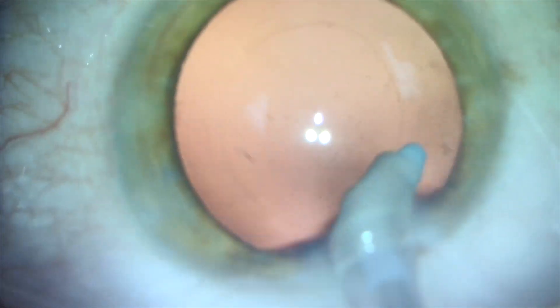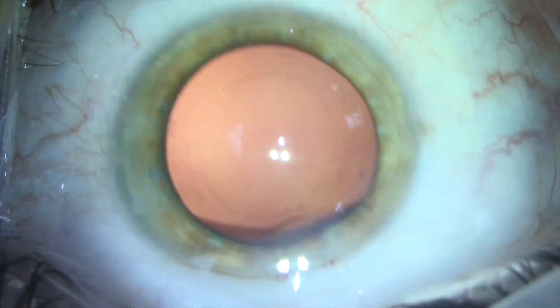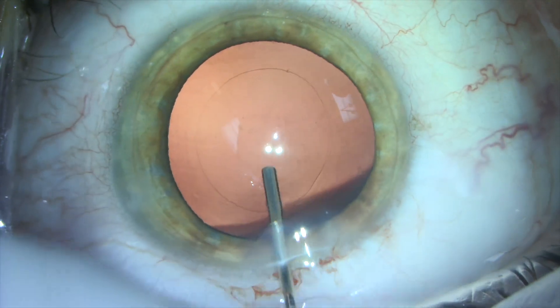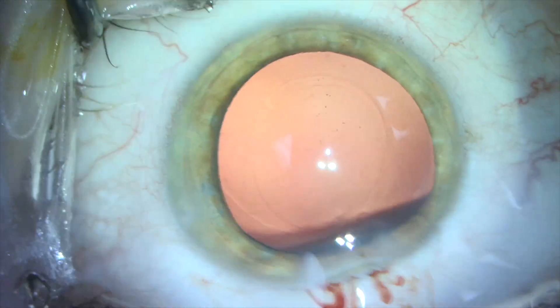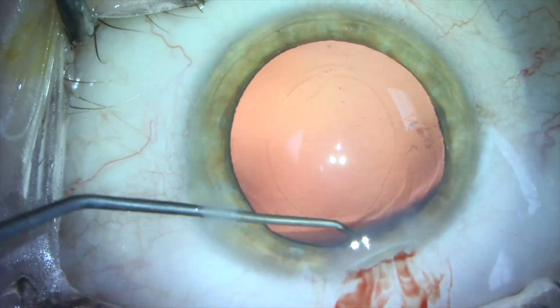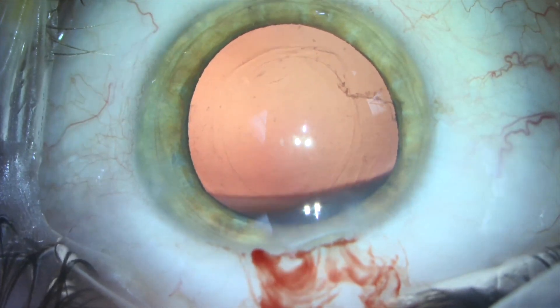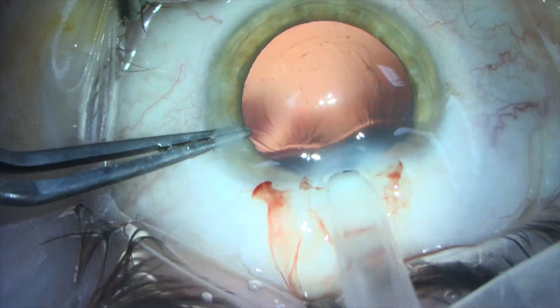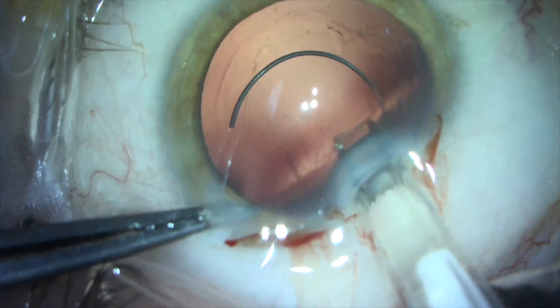In this patient, we've been able to successfully and safely remove the entire cataract, including the posterior polar plaque. Then we polish the peripheral posterior capsule and the posterior surface of the anterior capsule. We make sure not to polish the posterior capsule in the area where the posterior polar cataract plaque was.